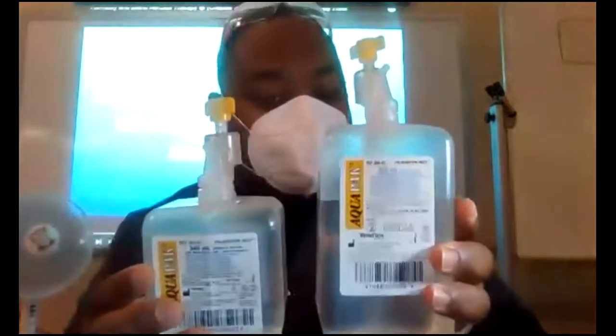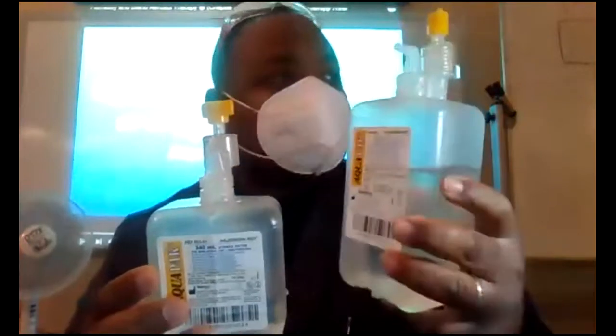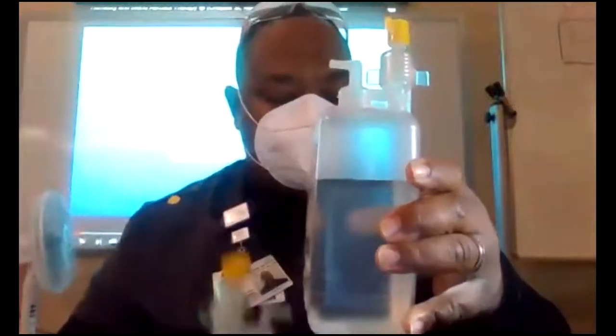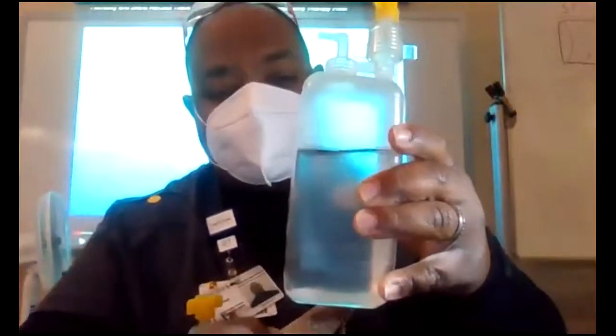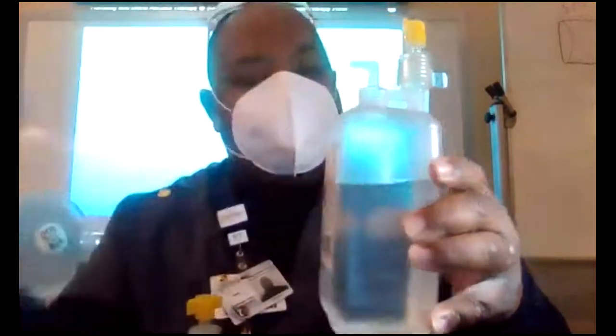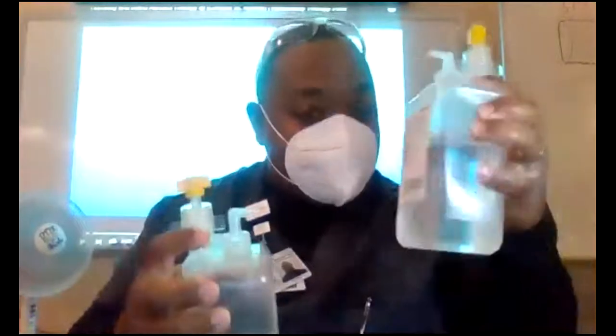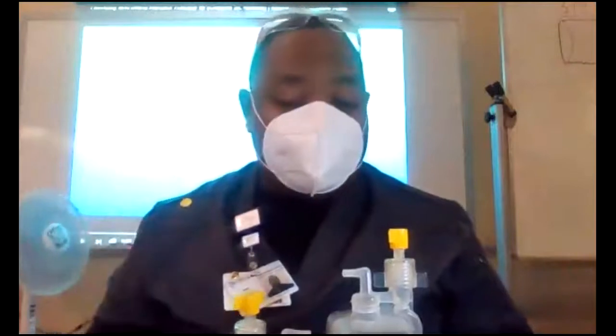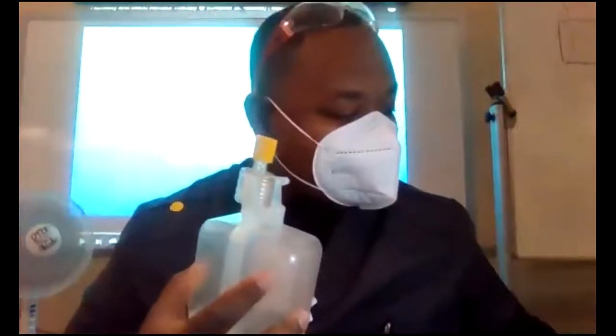Which one's gonna have a better humidity? The larger one, because it has longer time of contact. So as the water travels through both of these, the air or the oxygen that comes up from the bottom, it's got all this travel, picking up, then finally comes to you. Well, something like this, it only can pick up a little, and it comes to you. So the bigger the container or reservoir, the more time it has to contact with the water, and it's gonna pick up more humidity, okay? Common sense, this one's gonna be bigger because of the time of contact, all right?